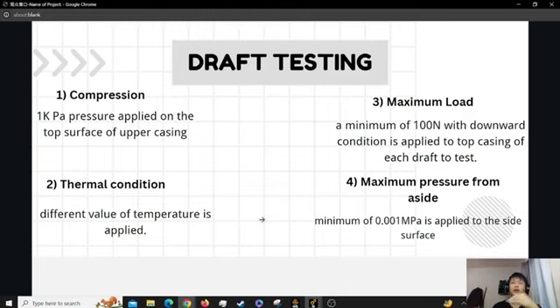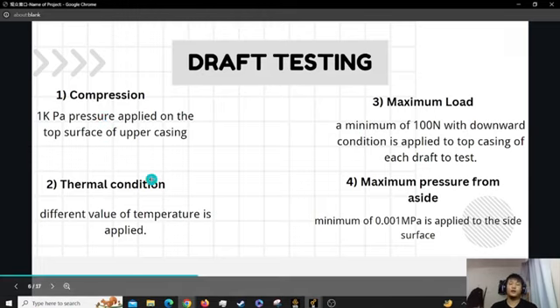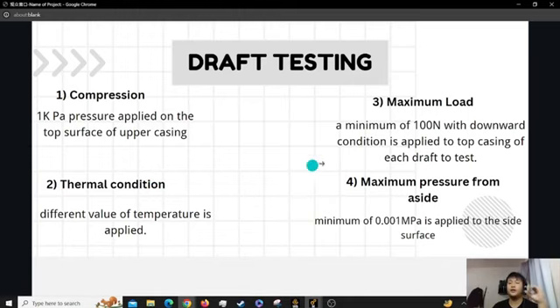The analysis part of the mini project can be separated into two parts: draft testing and material selection. In draft testing, there are four types of testing conducted to find out which draft reaches our expectations and which is the most satisfying. The first testing is normal compression, where we apply 1 kilopascal pressure on it. The second is we change the thermal conditions, applying different temperatures and conducting the compression test. The third is we measure the maximum load each draft can bear. The same applies to the fourth testing, where we measure the maximum pressure but from the side.